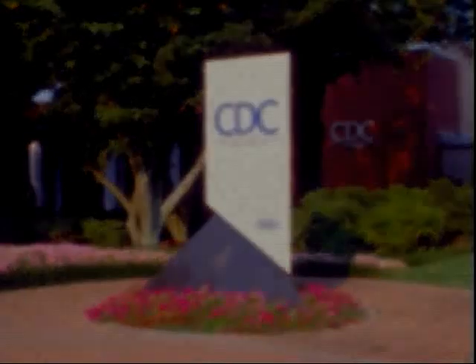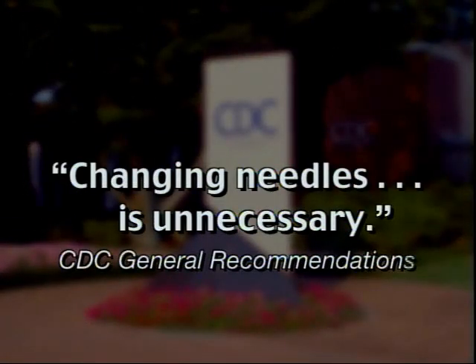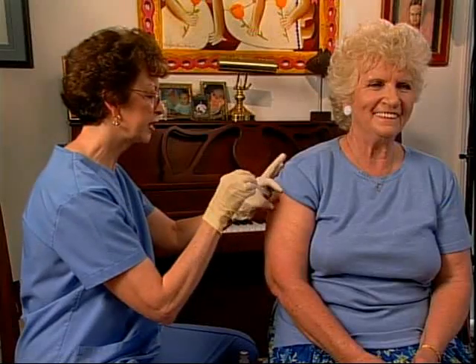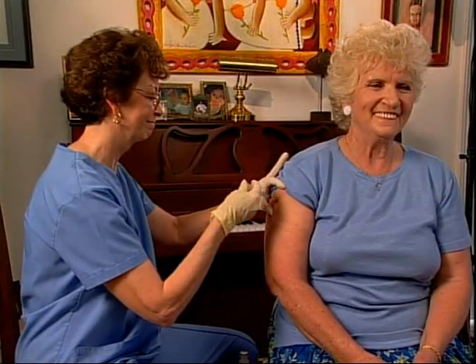The Centers for Disease Control has stated that needle changing is unnecessary. VanishPoint syringes are applicable for most injections and are easy to use.